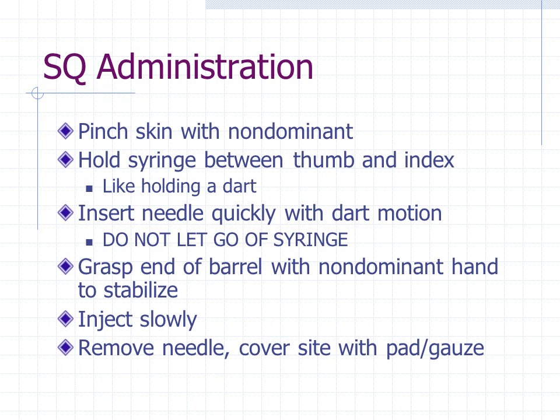Subcutaneous administration. Make sure that you pinch up the skin with your non-dominant hand. You're going to inject in a dart-like motion very quickly. Do not let go of the syringe. Grasp the end of the barrel with the non-dominant hand to stabilize it and inject slowly.